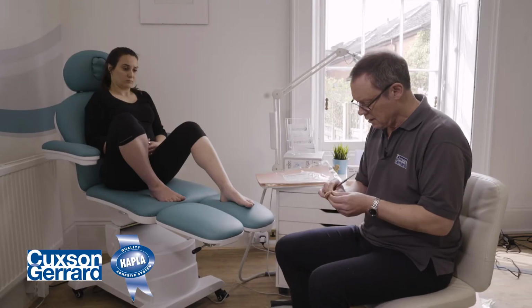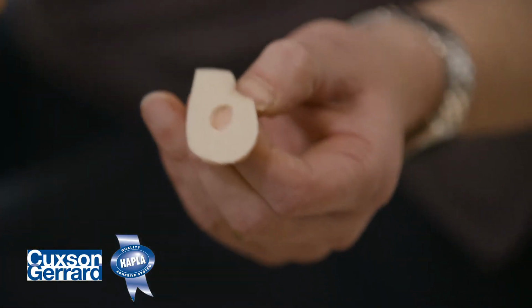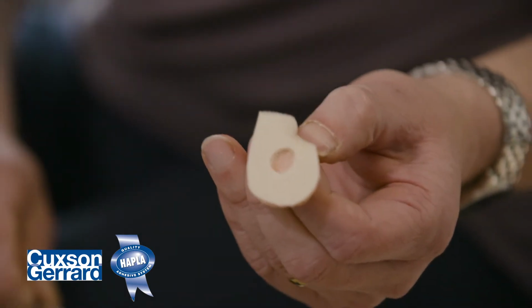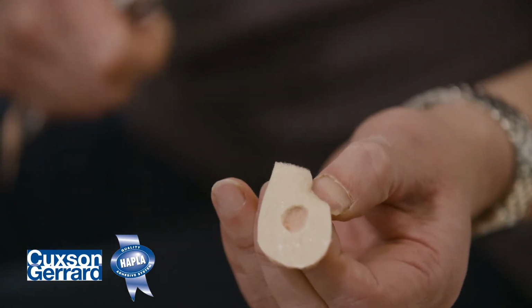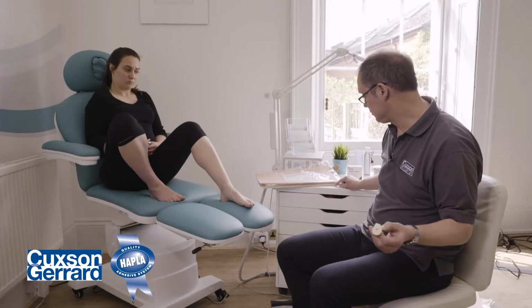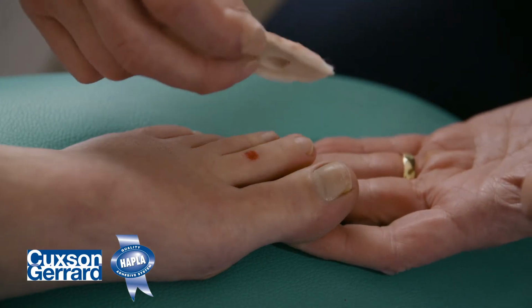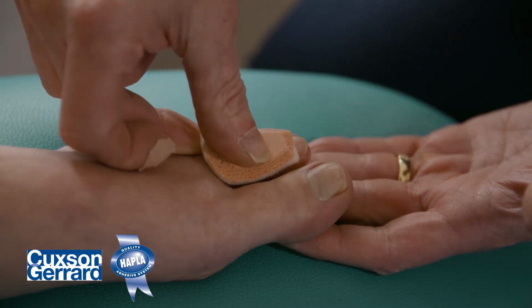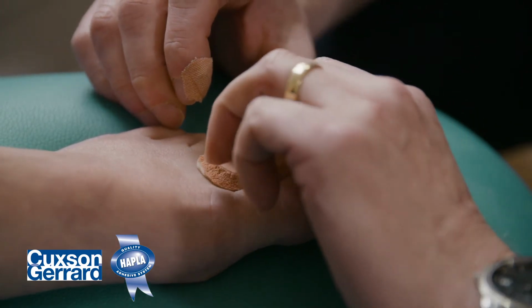Peel off the paper back. Now we can see more clearly the foam base in the aperture of the felt as we remove the paper back. So we only want to really go as deep as the felt and not really into the foam. Okay, let's apply this pad now. So centering the hole over the aperture over the lesion site, and the pad then just behind or proximal to the nail plate.